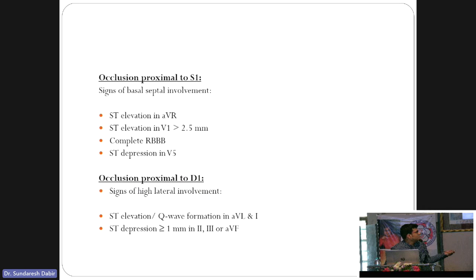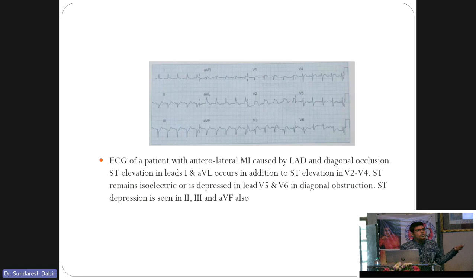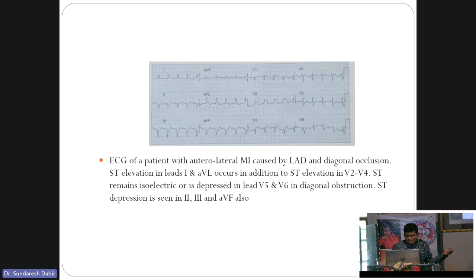An ECG showing no elevation in V1 or aVR, but elevation in V2, V3, V4 and in I and aVL suggests occlusion proximal to D1 sparing the septal. Because if septal were involved, there would be changes in V1 also — possibly RBBB in V1. Another ECG shows elevation in V2 through V6 and also elevation in leads II, III, aVF.